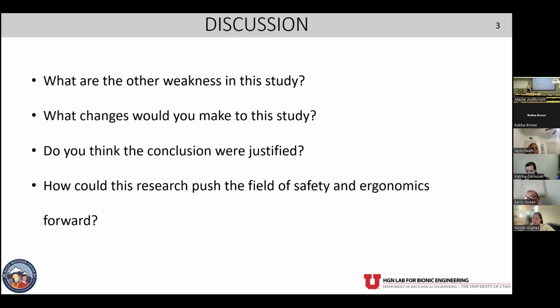In our lab, we're really lucky. We use an off-the-shelf sensor from Ottobock actually, and it's relatively easy to use. You have to prep the skin, so you're shaving the skin, using an alcohol wipe, and you put it on, and then you ask the person to flex and check: did I get a good reading on that? So I would imagine it could have taken well over an hour to get all of these EMG sensors correctly placed. Once you get them correctly placed, you're pretty well off.